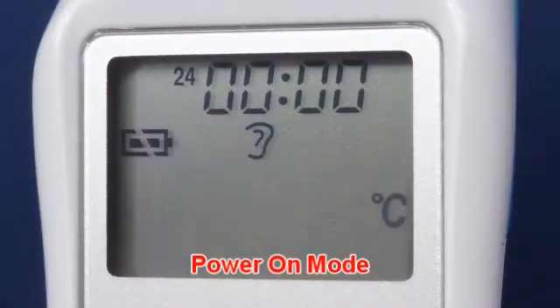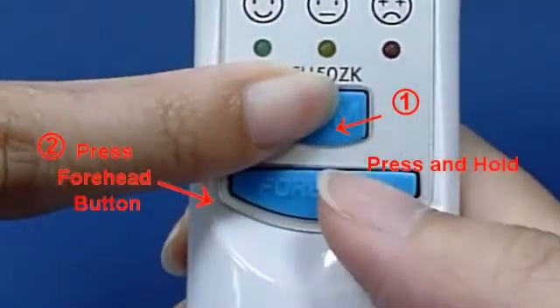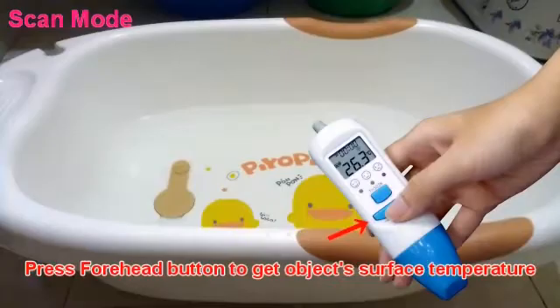In Power On Mode: press and hold the On Memory Button, then press the Forehead Button. You can see the scan icon on the LCD screen. Press the Forehead Button to get the object surface temperature.